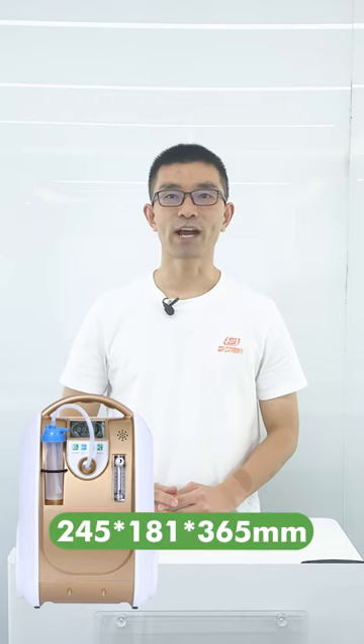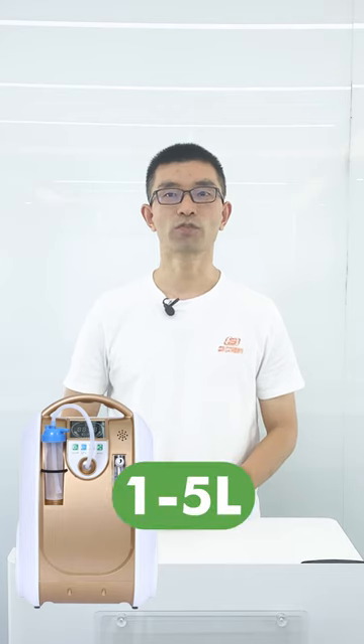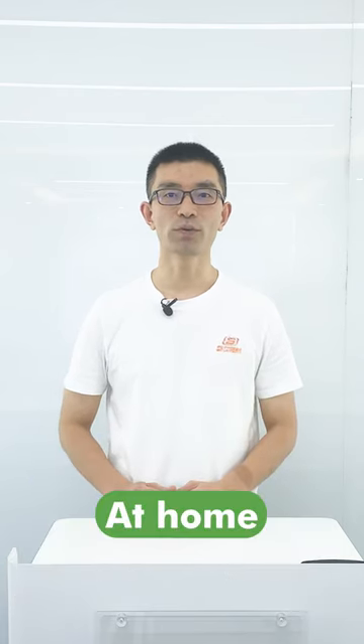The O-Airway B1 size is 245 x 181 x 365 mm. The net weight is only 5.4 kg. The product can adjust the oxygen flow rate from 1 to 5 liters. It is equipped with a backpack and a cart. You can use it at home or outdoors.